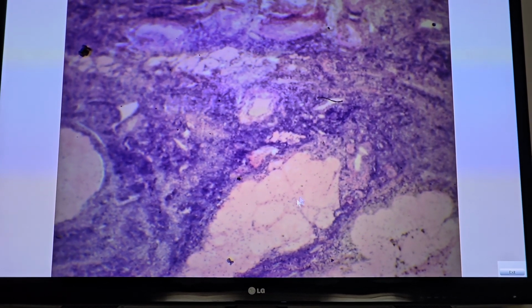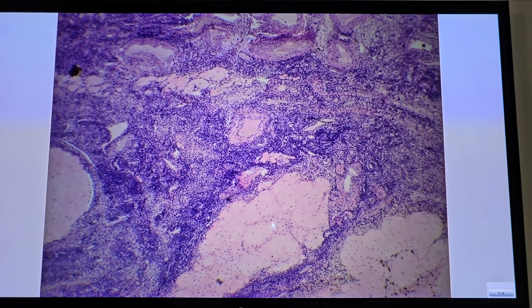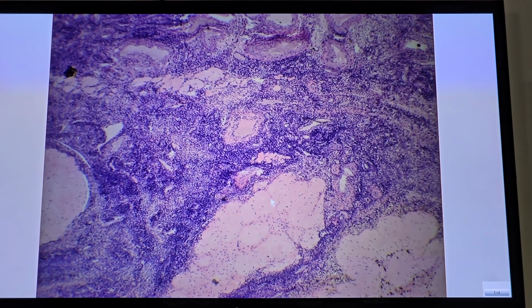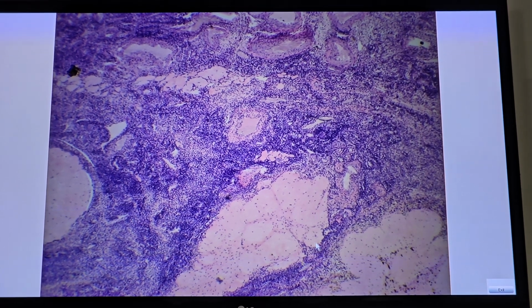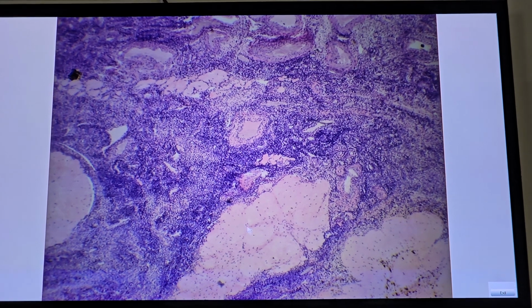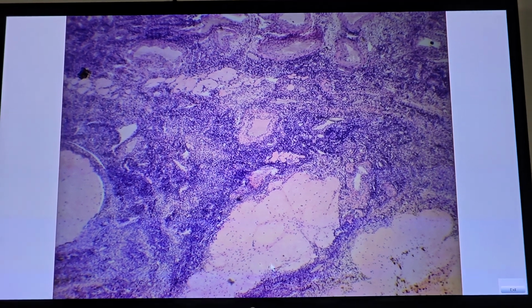If fertilization doesn't occur, fibroblast from stroma invade the region of corpus luteum, forming a scar tissue, and this region is called corpus albicans. Appear as a whitish area. Corpus albicans.